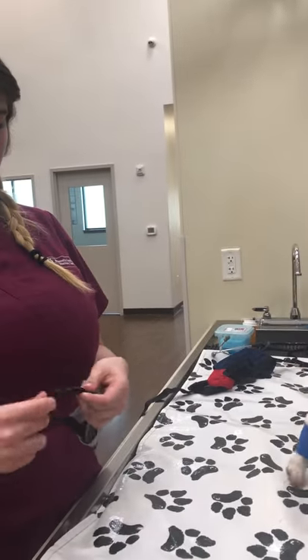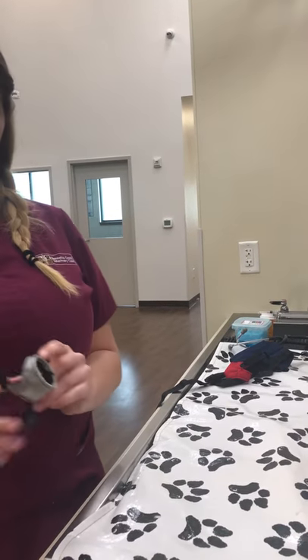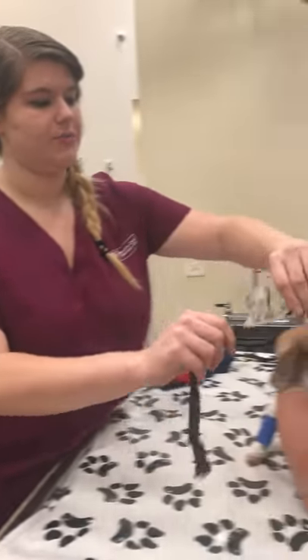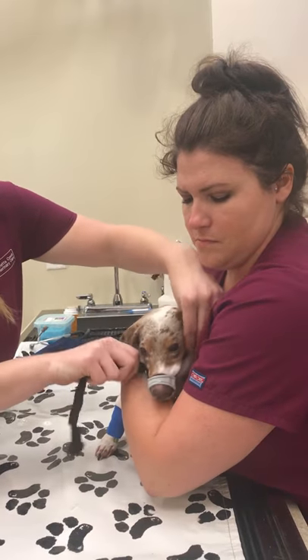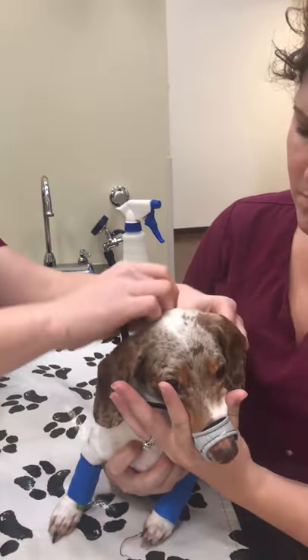Unbuckle the muzzle and make sure you have it pulled out enough. The small part goes on the top, and you're going to put it around the patient's muzzle there, behind the ears.